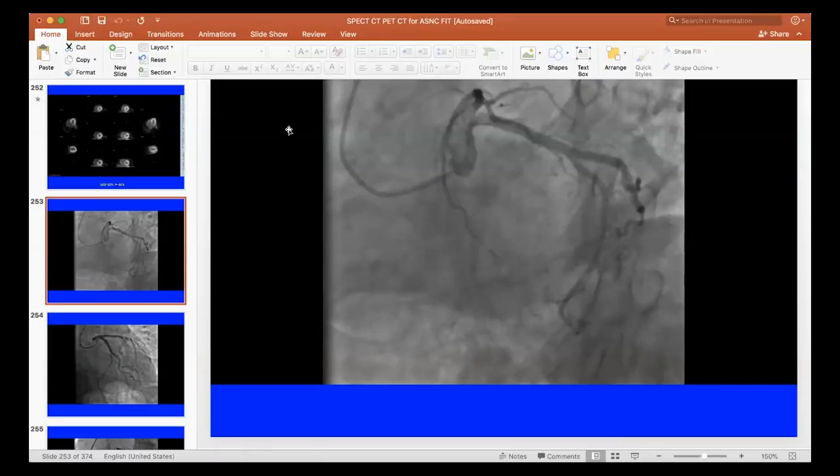Yeah, he could not have an MRI because of this experimental ear implant that he had. But either way, I think considering this syncope, heart block, bradycardia, maybe FDG PET would be a better option. Yeah, maybe so. Well, he got a cardiac cath because of the reversible defect, it looked funny.